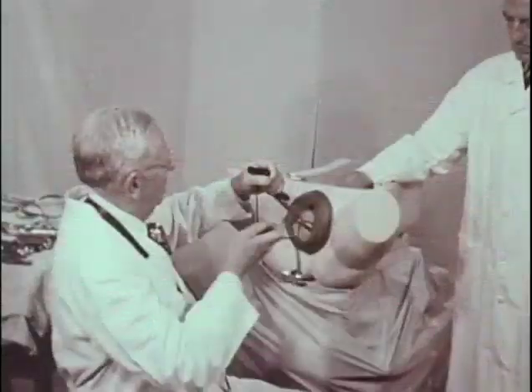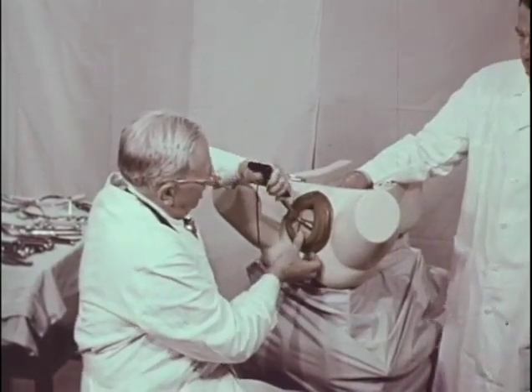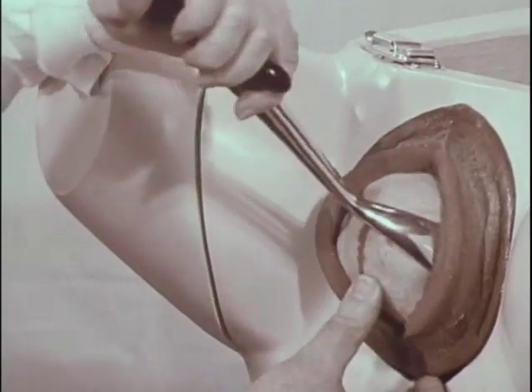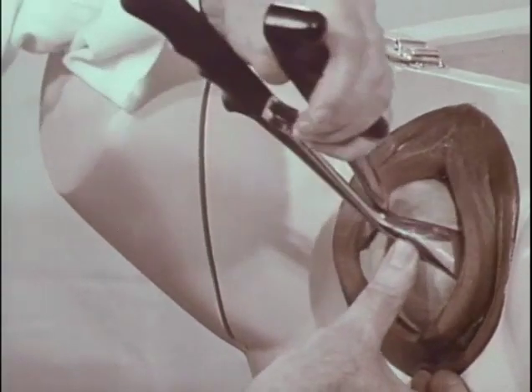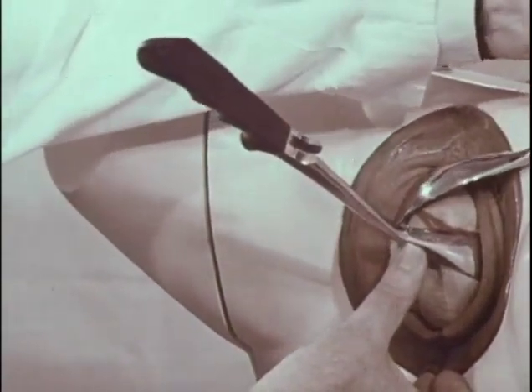As soon as the chin can be controlled with the Ritgen maneuver, the handle is removed, and then the head is extended. And then the forceps are removed in the usual manner.